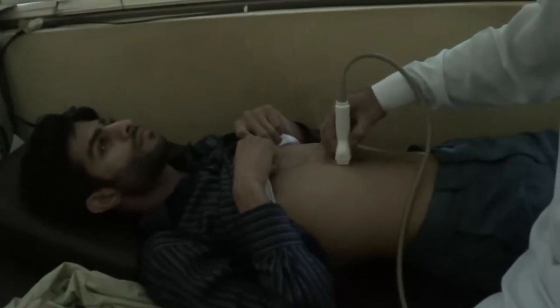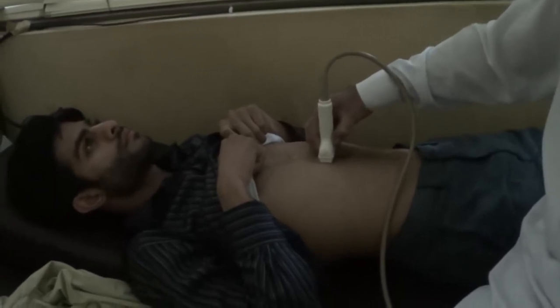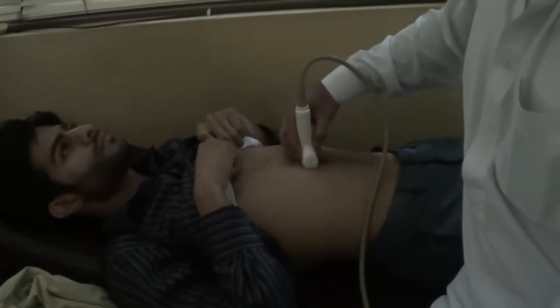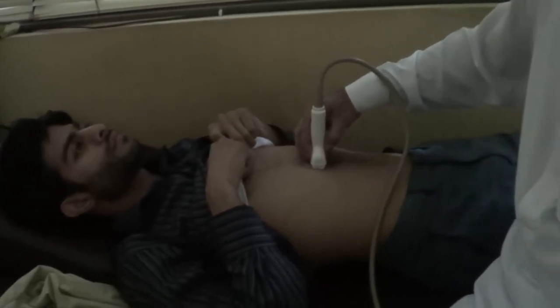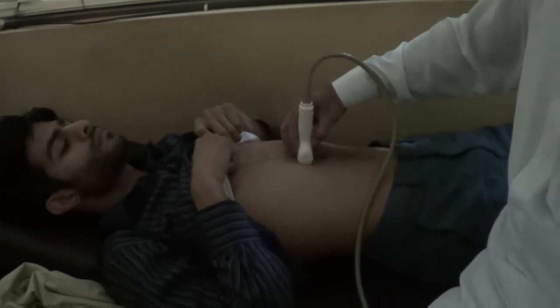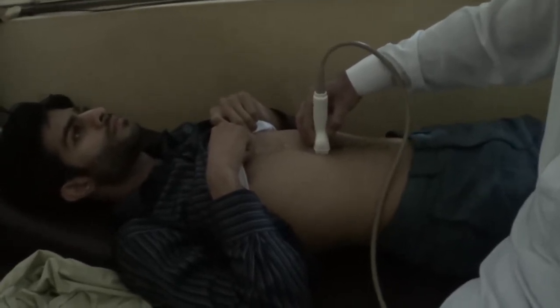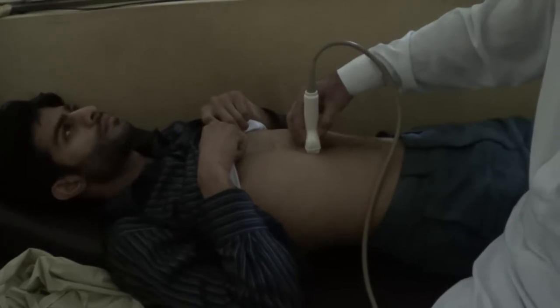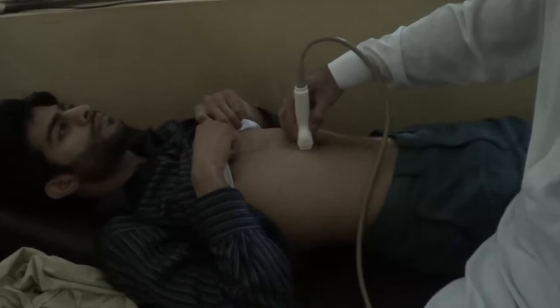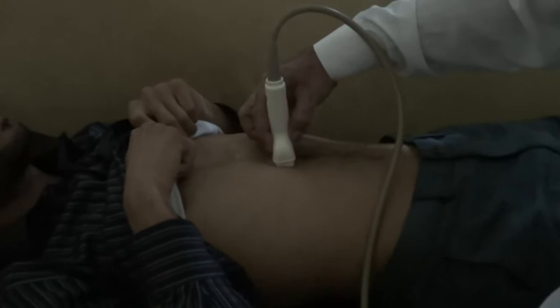So this is a patient, age 22 years, with the complaint of weight loss and epigastric region pain for the last few months. There are no laboratory findings available, and no clinical notes or any other imaging material is provided. So I have placed the probe in the epigastric region and we are going to scan.